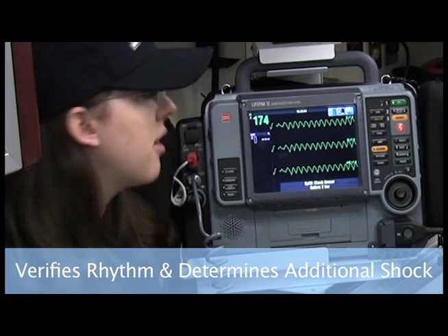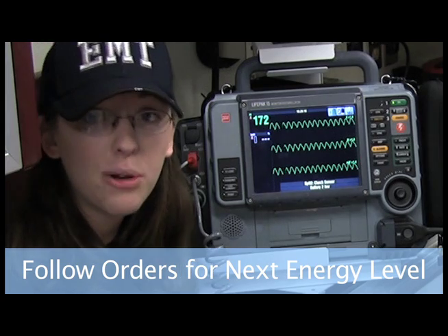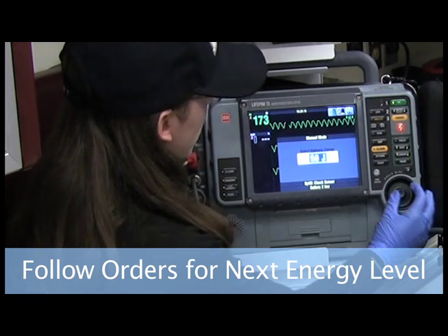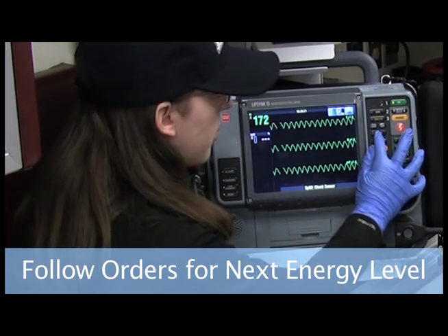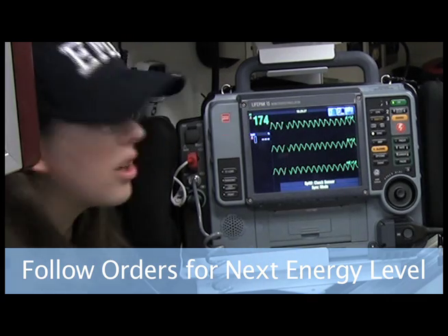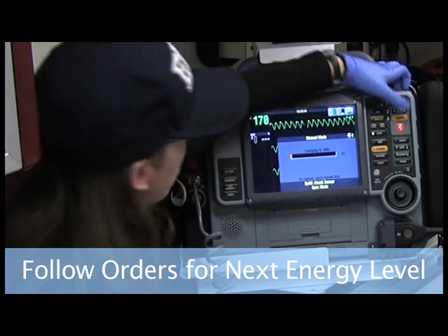Now I want to recheck the monitor and I am still seeing a wide complex tachycardia. So med control has allowed me to shock another time at 100 joules. Energy select at 100 joules. I want to make sure that we're synchronizing — I am noticing the flashing light, I am noticing the triangles, so we are ready for our second shock. My pads still look good.